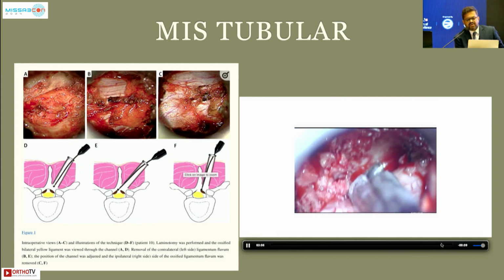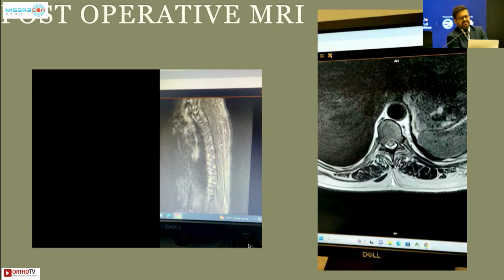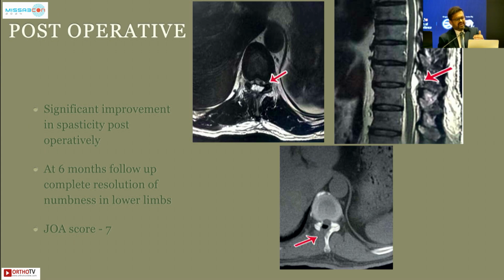The nuance I would like to show is, while passing the 1 mm upcut on the contralateral side, we need to take the footplate parallel to the lateral aspect of the thecal sac and then go underneath the ligamentum flavum and remove it. This will prevent injury from direct compression of the cord and worsening post-op.